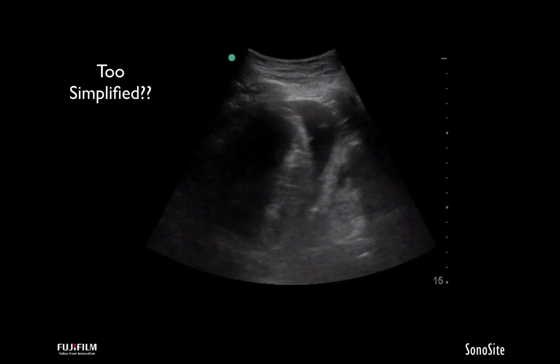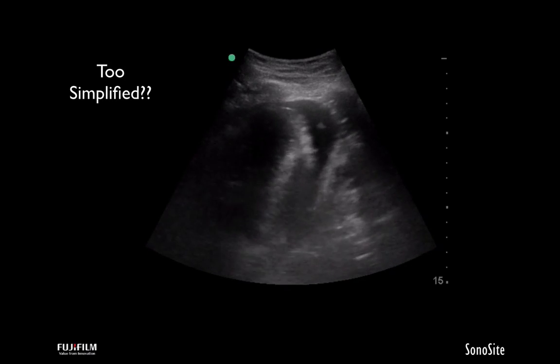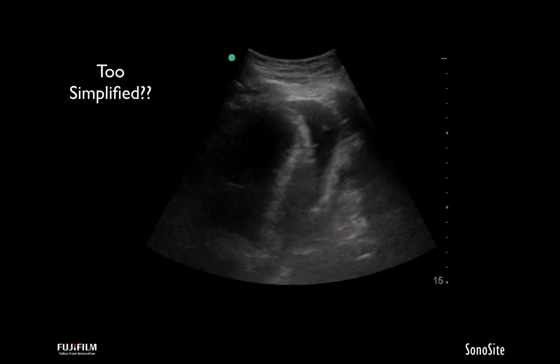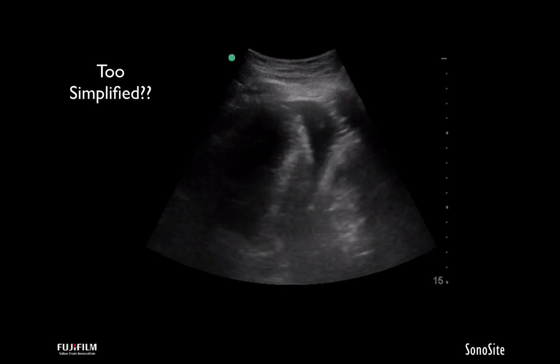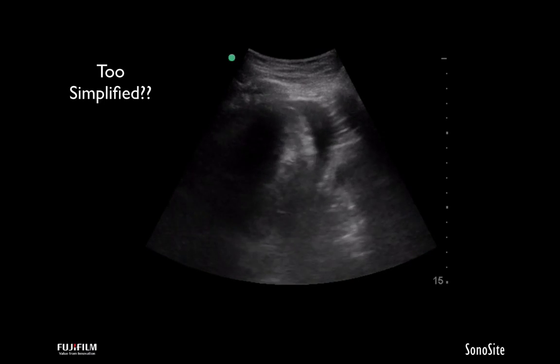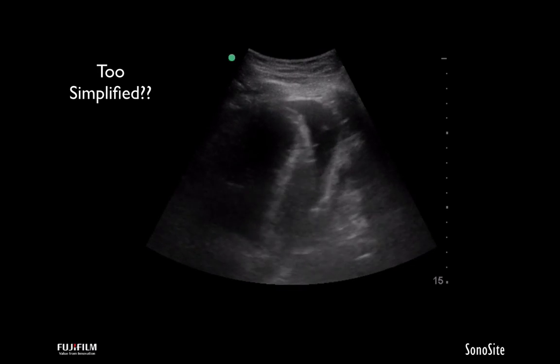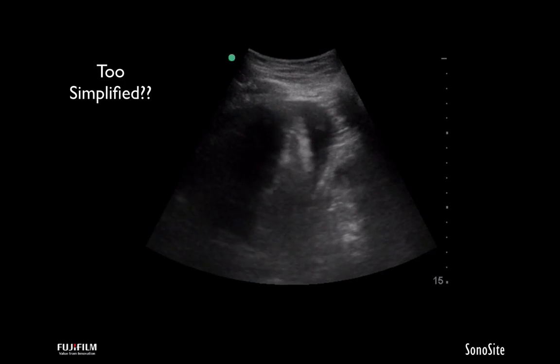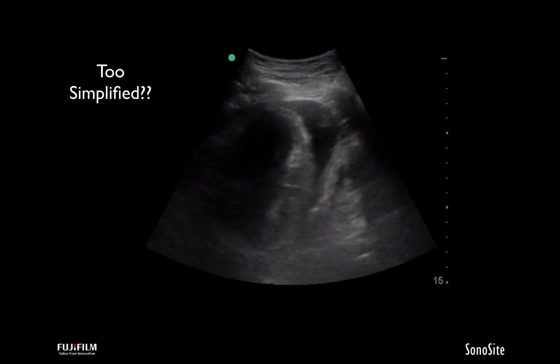This is a patient who came into our ICU. He was actually a patient that coded in the field, with return of spontaneous circulation. In the ED, he had therapeutic hypothermia, actually was on Coumadin, and went to the cath lab. He was cathed, and they found a stentable culprit lesion, placed a stent, and the patient started oozing from that stent and then had tamponade from bleeding into his pericardial space. Nobody wanted to put a needle into this guy's heart, and we really had no other option.